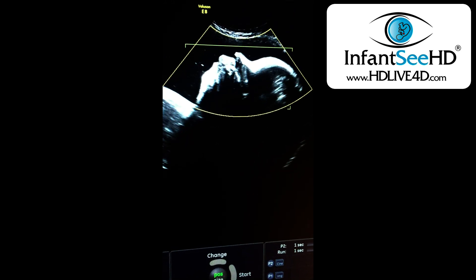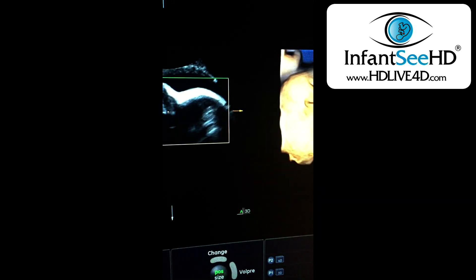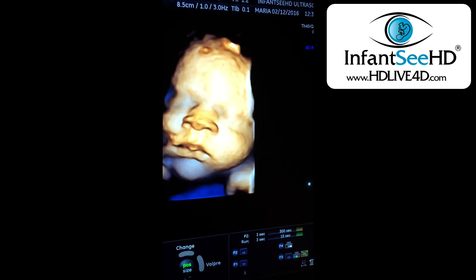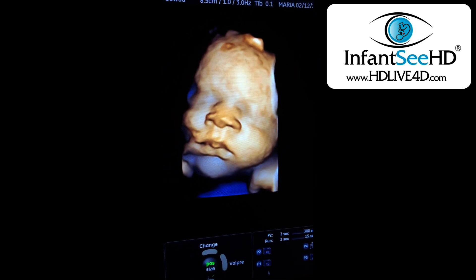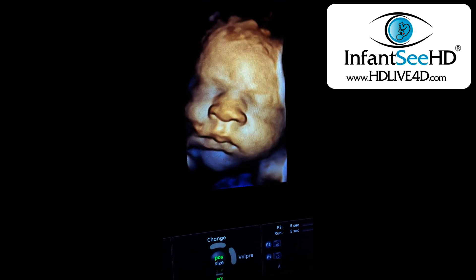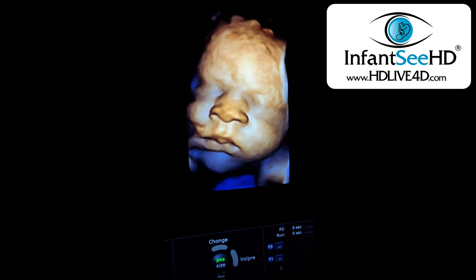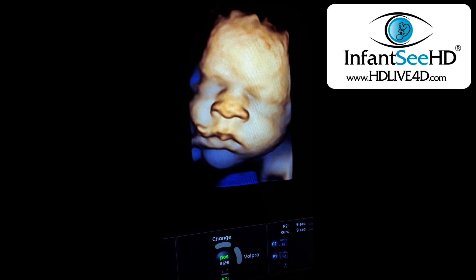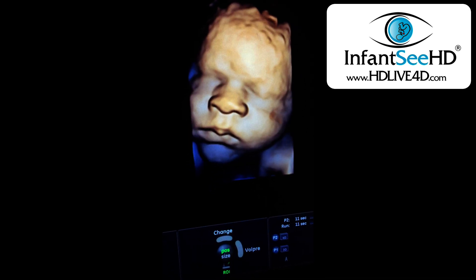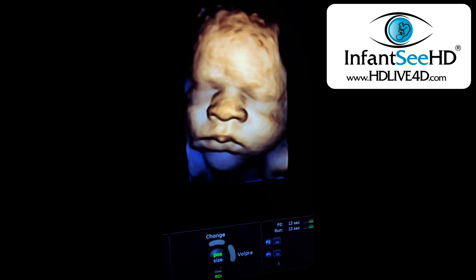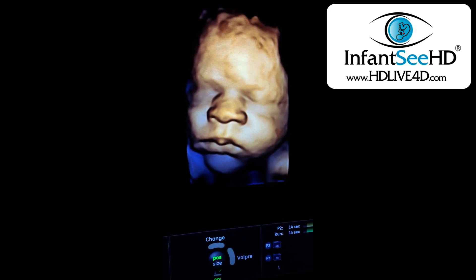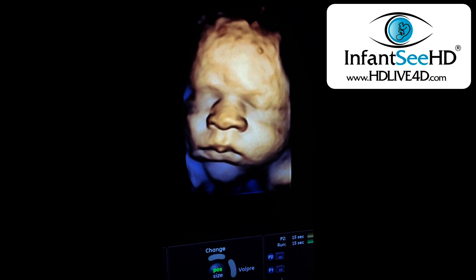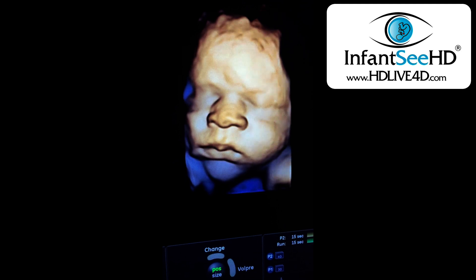This is now going from 2D to HD. I'm going to flip the baby 180 degrees here because the baby is head down. With our systems, I've actually even reduced the speckle with some speckle reduction imaging. This is HD, which is so much more superior than the previous 3D and 4D technology.